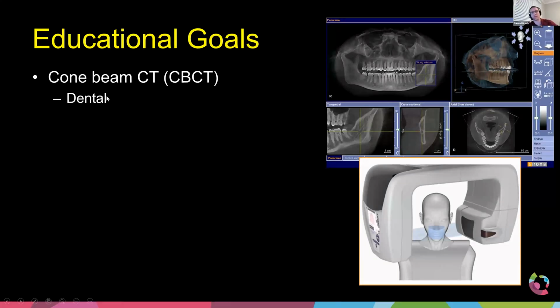So today we're going to talk about the two more common areas of cone beam CT application outside of, quote unquote, typical radiology. And the first one is dental. These are cone beam CT scanners. They're dedicated. They're almost always found in dental clinics or units. And you can see it's a C-arm, very much like a fluoro system, where you have the detector on one side and the X-ray tube on the other, and the system can still spin around the body because of its geometry, and so we can get nice, good imaging of the face.